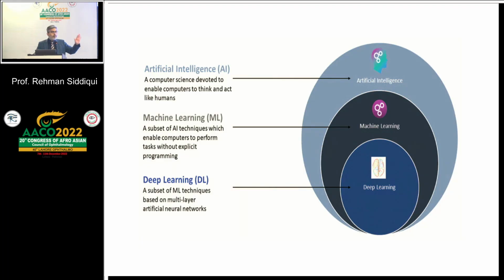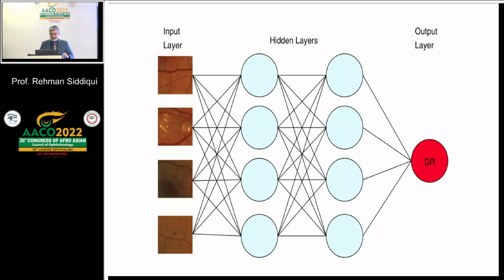And if you just label the image, don't extract features, and just throw those images at the deep learning model, it extracts those features that we think are important, and a lot of the time it extracts features that we are not even aware of. For example, the way it's detecting age and gender, what are the features it's looking at? We don't know. And that's the black box. But the advantage of deep learning is that you just have to give a label to the image, that this is a dog or a cat or a horse, car or a plane, and it extracts features and it learns.